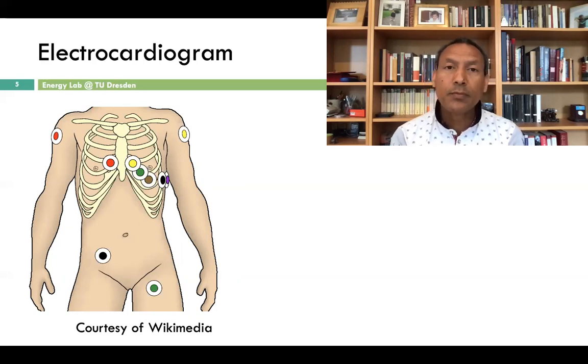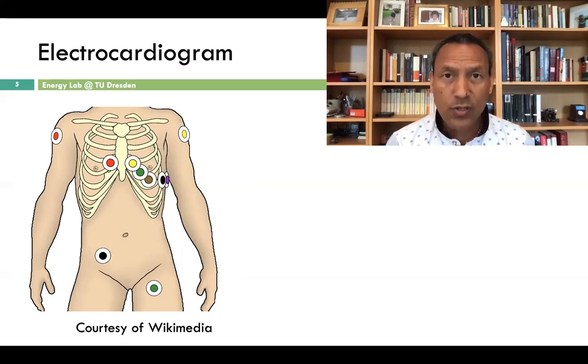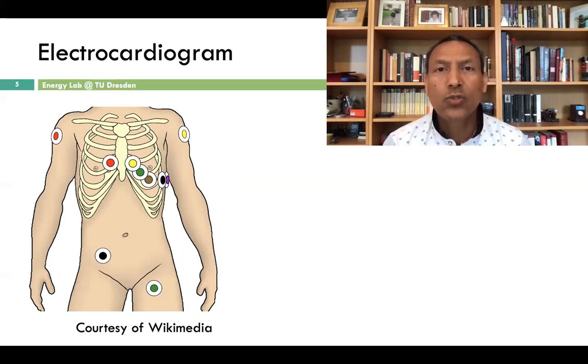walls. The problem with relying on clinical electrocardiogram is that during diagnosis, the period is typically short, and the patient is resting, in which case the heart is not really exerting. So it is not the ideal place to observe the heart. If the person was freely moving and exerting, then we can determine whether the heart was responding properly.